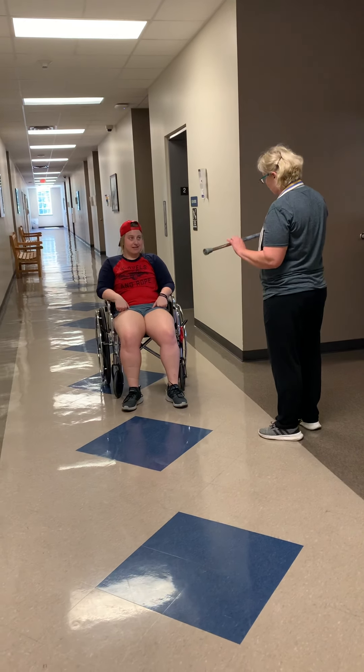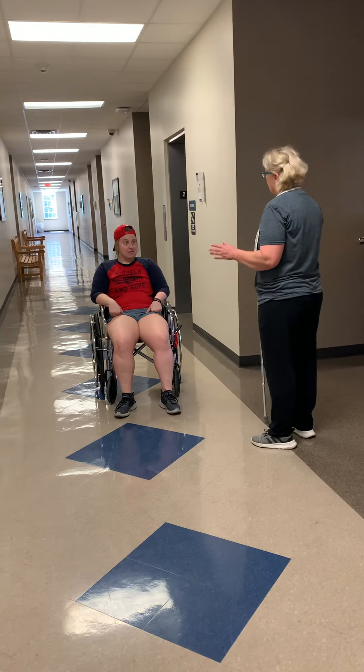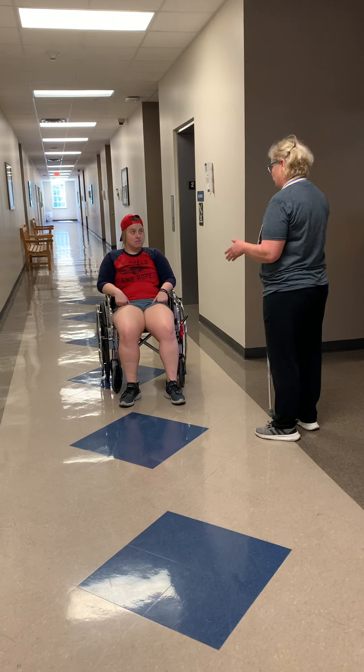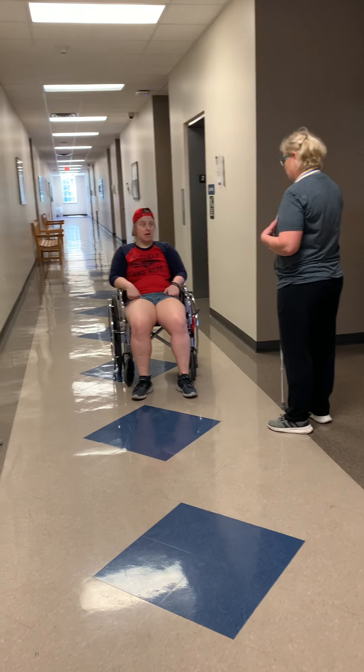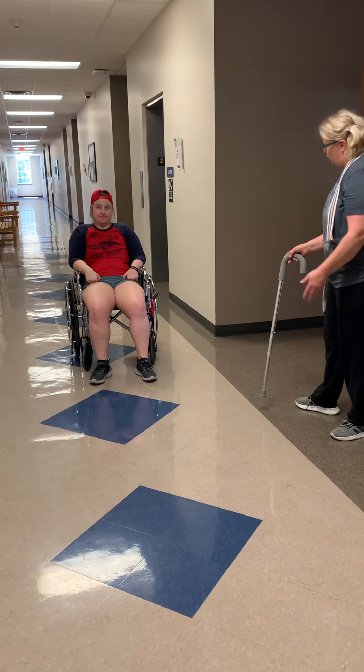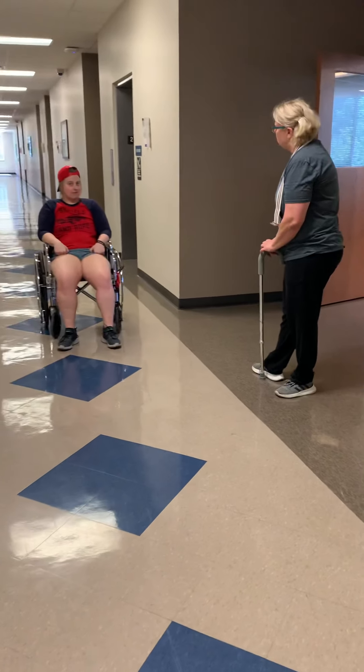What we're going to try to work on today is just to walk with this cane. It says here on your chart that you are full weight-bearing, Mary. You just have a little bit of dizziness. Well, this will help keep you a little steady. So what you're going to do — what side is your dominant side? Right.